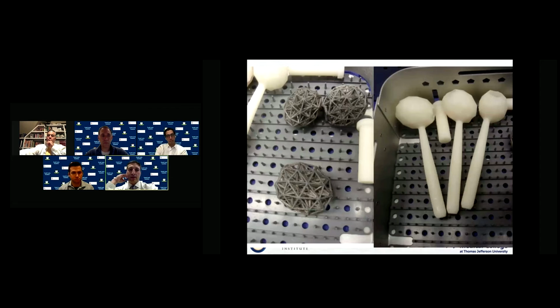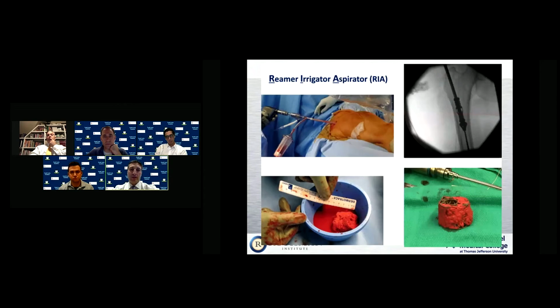So these are images of what the cage looks like in real life. This is not, again, the cage that I used in this case. I just didn't have the pictures to illustrate, but I want to give you the idea. On the left side, you can see there are three of them. Usually you get one size that you design specifically, and then there's a nominal increase and decrease, usually on the order of about 10%, so you can account for any changes intraoperatively that you didn't necessarily anticipate, whether it be leg lengths and so forth.